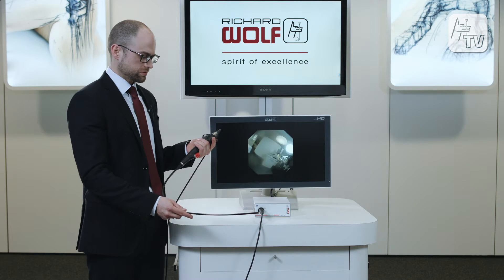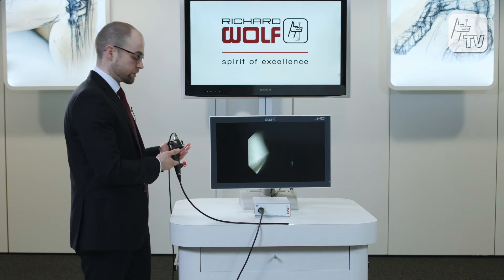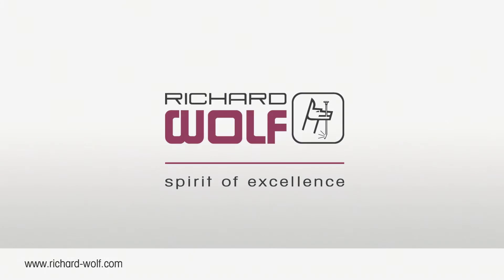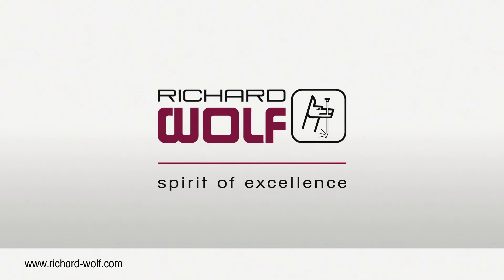All of this together — the Endochem Flex camera and the three new bronchoscopes — provide a superb image and an excellent value for the money. Richard Wolff: Spirit of Excellence.